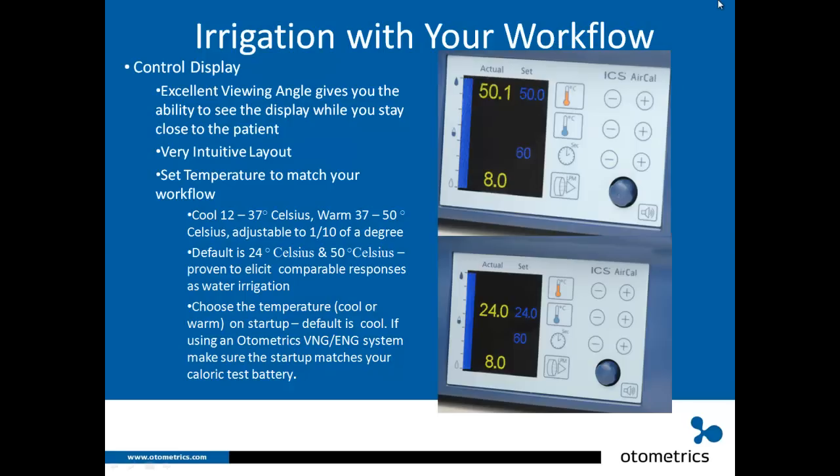It's a very intuitive layout. Orange is warm, blue is cool, with up and down arrows to change the set temperatures. You have a seconds display for the countdown timer, changeable with plus or minus. The liters per minute setting controls the airflow on and off. There's also a button to change the intensity of the beep that tells you irrigation should stop.